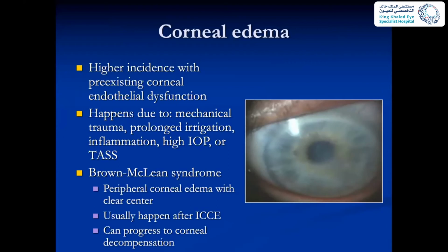There is fluidics with the phaco procedure, and this fluidics can cause some form of trauma to the endothelium, especially if the procedure took too much time, you are losing endothelium with time. Inflammation also can cause corneal edema and high intraocular pressure.